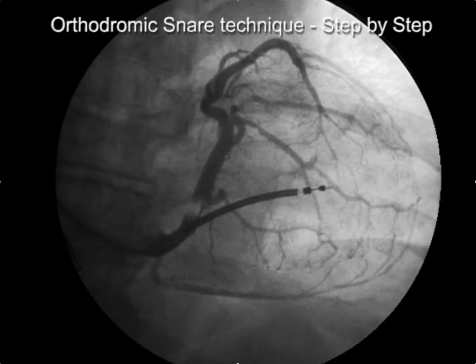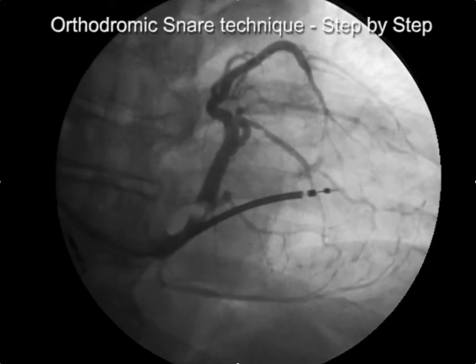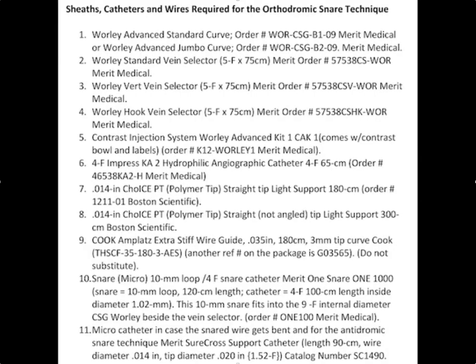This is the orthodromic snare technique, updated August 20th 2018. We'll go over this each step. This is a list of the equipment that's necessary — each of these is important, including the type of wires you use and the snare. All of these need to be available to do this properly. For getting a wire through the collaterals, you need to make sure you have a polymer tip floppy wire.